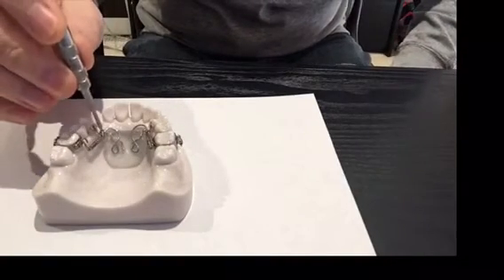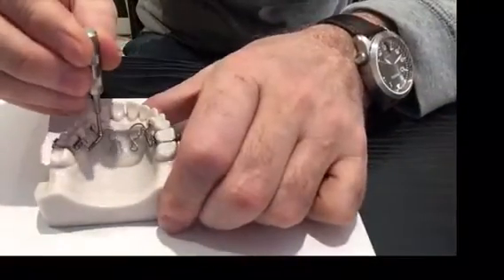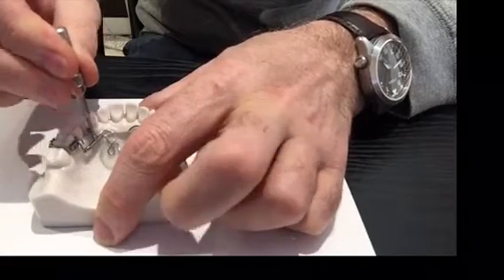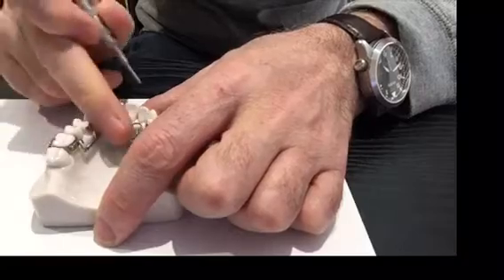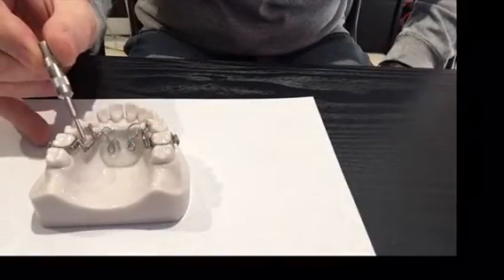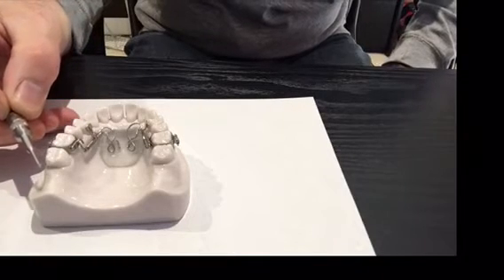This key goes into this little lock nut right here. You loosen the lock nut, you slide the lock along to compress the coil spring, you lock the lock nut again and remove this little key. Now you have this coil spring which is compressed right here, and that will put pressure on that molar and distalize it.